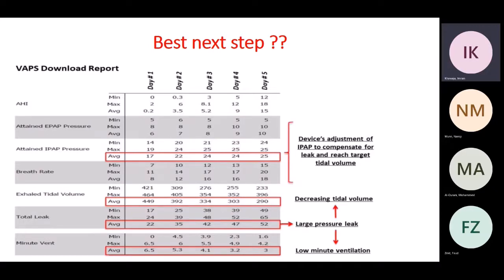So the Philips Respironics machine is going to report the total leak, okay? Since it's reporting total leak, there should be some numbers, because it is intentional plus unintentional. We need that to be between 20 and 40 for a full face mask and less than 25 for a nasal mask. But ResMed doesn't tell you about that. It only reports the unintentional leak because it takes the intentional away from the equation, okay? So the number should be something close to 0 if the mask is okay.